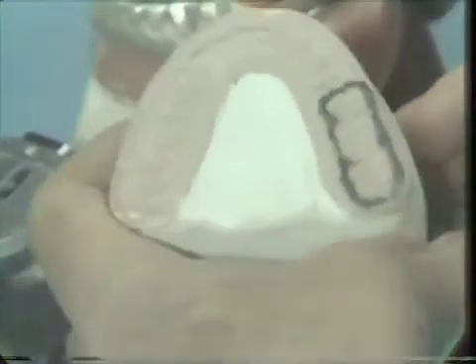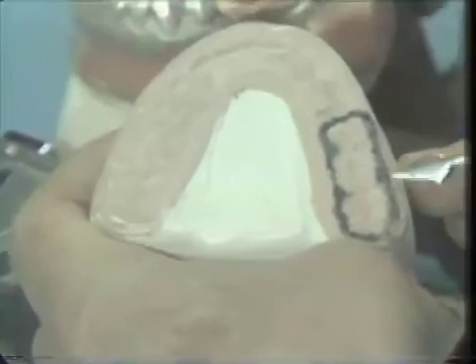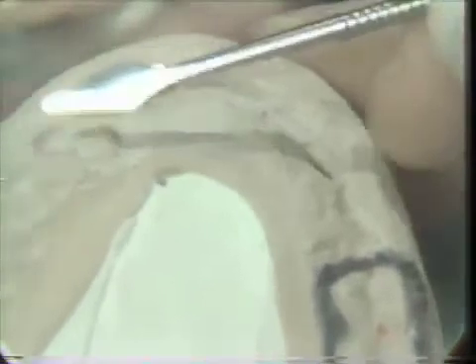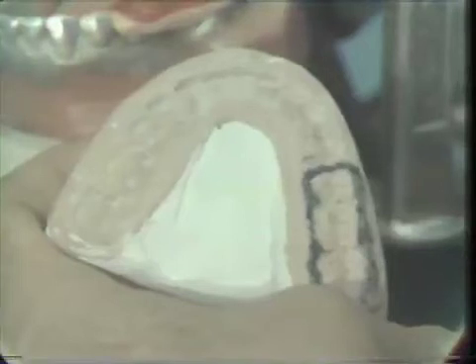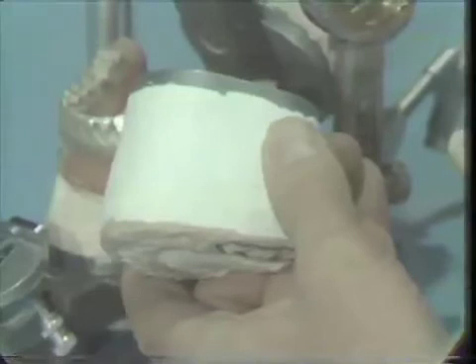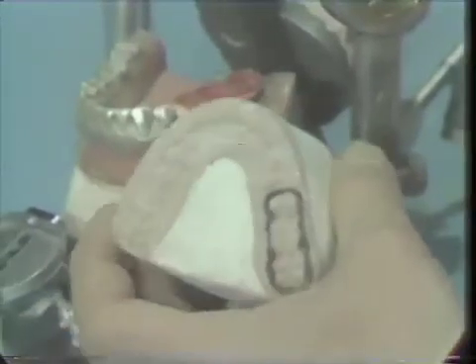And this is our finished stone key, and we've outlined the functionally generated path area in black so it will be a little more readily discernible. And this is approximately the correct amount of registration that we would like on the balance of the dentition. We've now mounted our anatomical cast, and our functionally generated stone key has been prepared and mounted with a ring so that we can index this on the articulator, and now we are ready to send our case to the laboratory for the waxing and casting procedures.